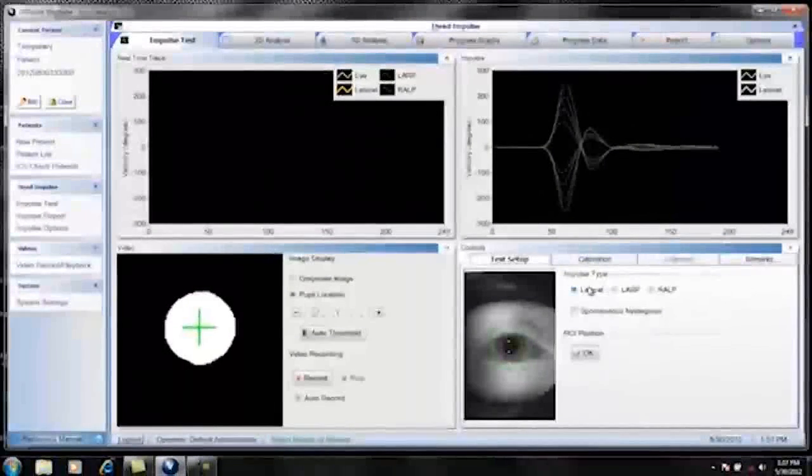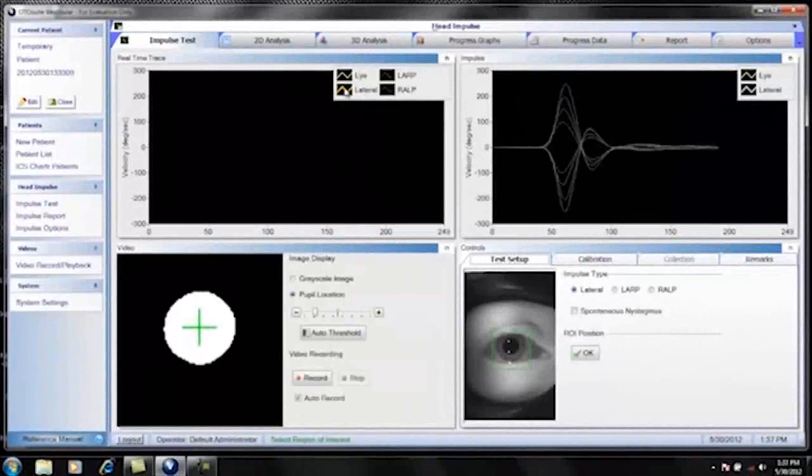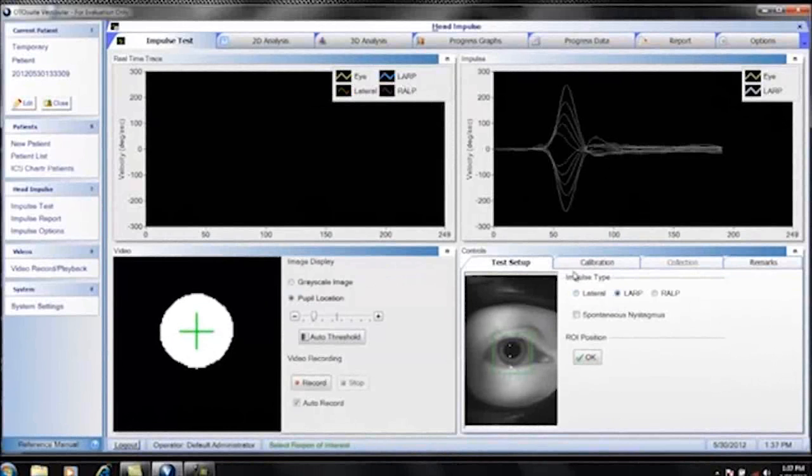When you choose lateral, notice that the lateral head trace is in bold. If you choose LARP, the blue head trace for LARP is in bold, and if you choose RALP, the pink head trace for the RALP is in bold.